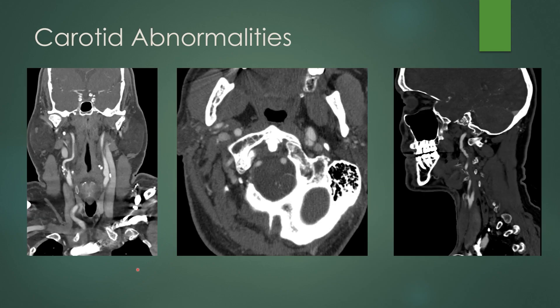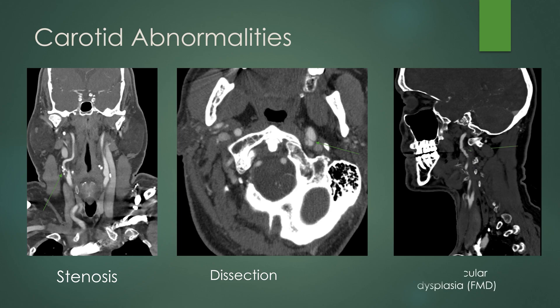Carotid abnormalities have been associated with pulsatile tinnitus, ranging from carotid stenosis — here you can see significant carotid stenosis caused by complex plaquing, as opposed to the left where there has been a carotid endarterectomy — to a dissection, where you see the intimal flap with dilation of the vessel, or fibromuscular dysplasia. Here's the beaded appearance of that mid to distal cervical ICA, the classic appearance of fibromuscular dysplasia (FMD).